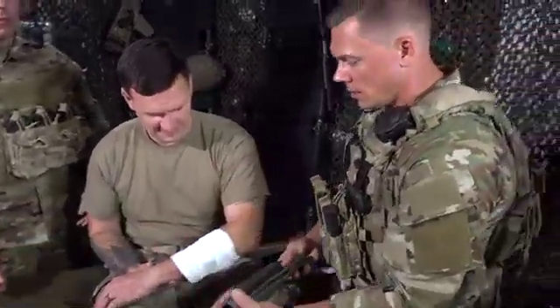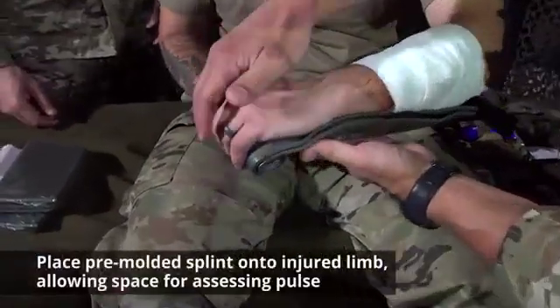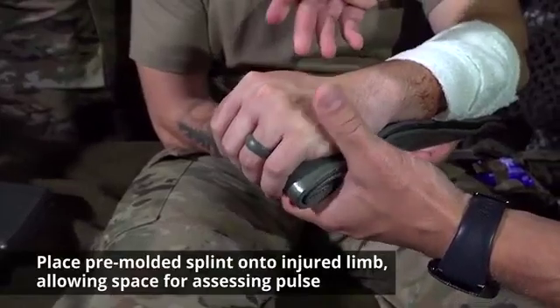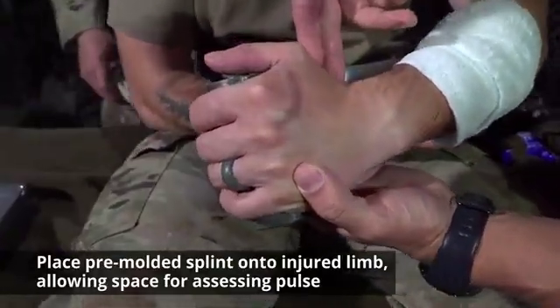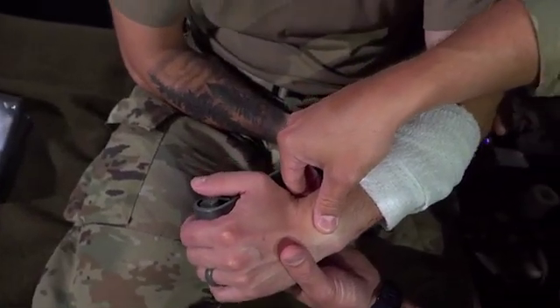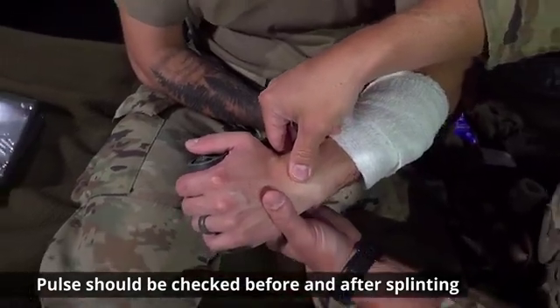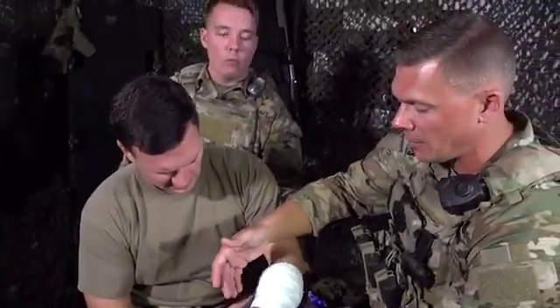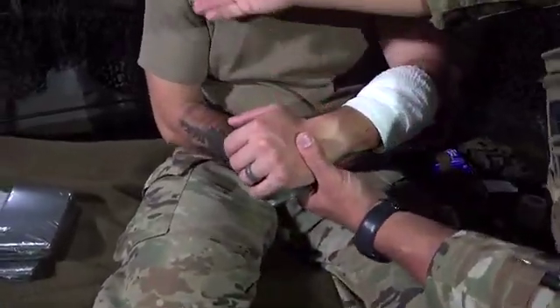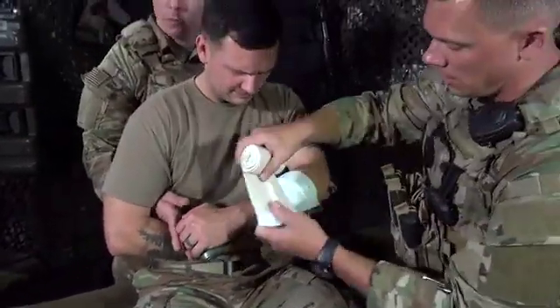Jack has the splint pre-measured on the unaffected side. You'll notice he's got a roll on the end to keep the casualty's hand in a neutral position, and he left a spot where I can reach in and check the patient's pulse. Before we splint and then again after, we want to make sure the casualty maintains that pulse and that we haven't caused any constricting effects.